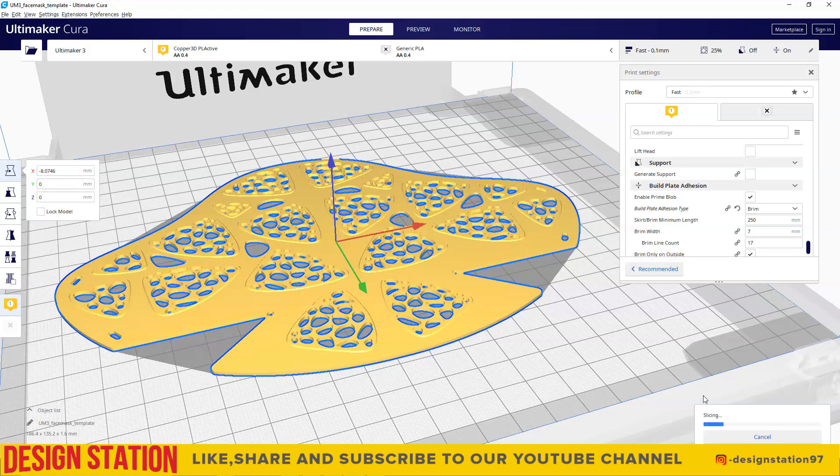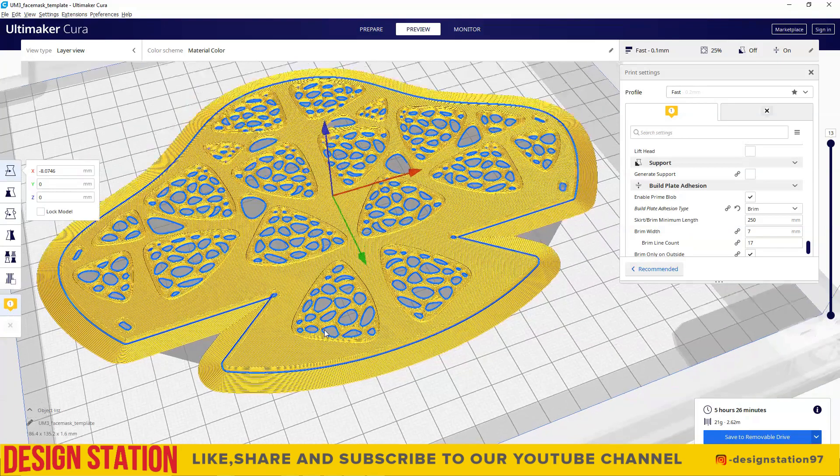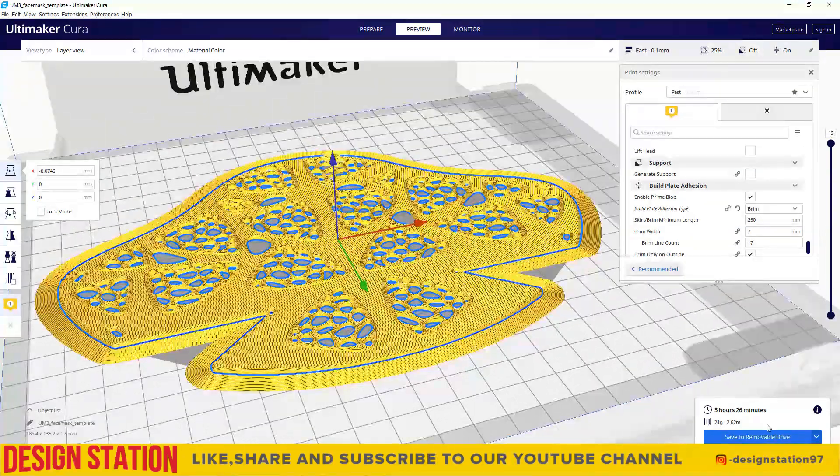It shows us how much time it takes for the 3D printing and how much filament is consumed. Save the G-code into the USB after slicing is done and plug into the Ultimaker 3 3D printer for the printing to begin.